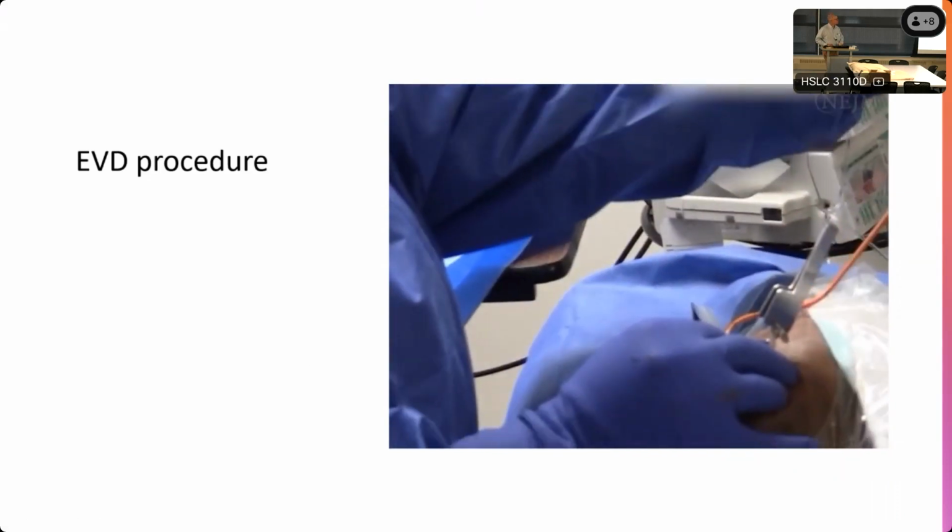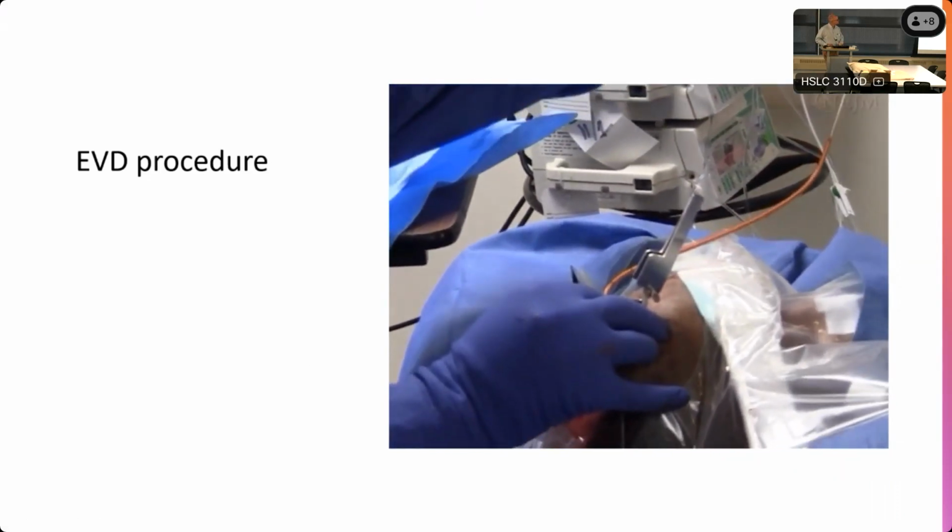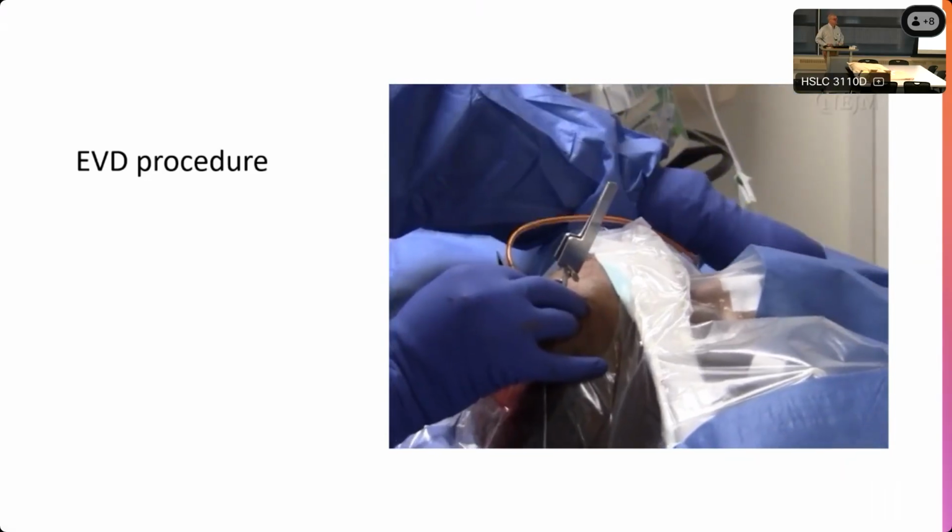Withdraw the stylet to check for CSF. Do not advance the stylet more than 6.5 centimeters.